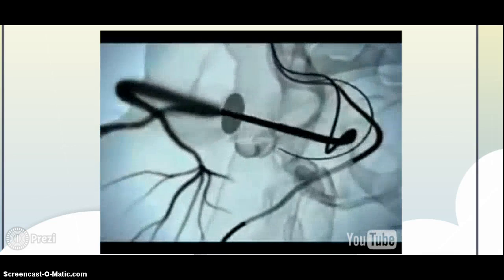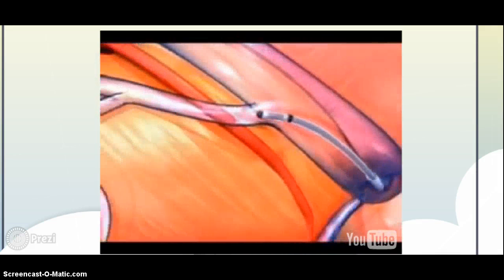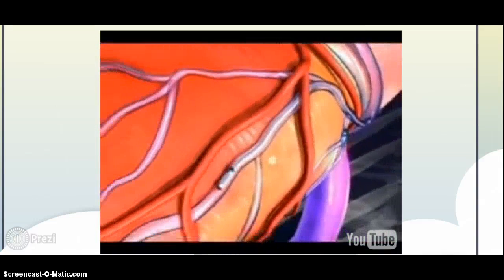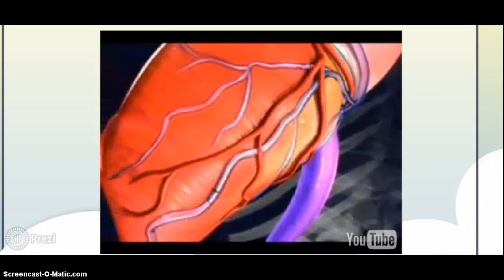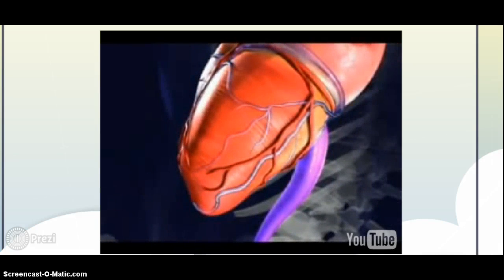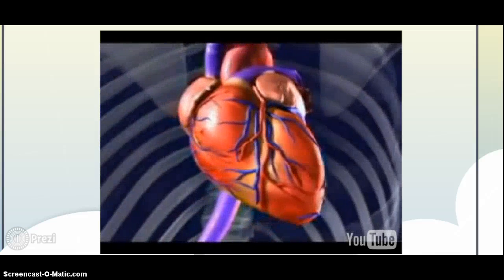After the proper location is chosen, a left ventricular lead is placed through that catheter — a small tube allowing positioning of the lead — and inserted into the target vein. The image here shows the lead being introduced into the distal, or furthest, part of the vein that provides the best therapy. After this lead is positioned and secured, all the wires are attached to the generator, which provides resynchronization and improvement in heart failure symptoms.